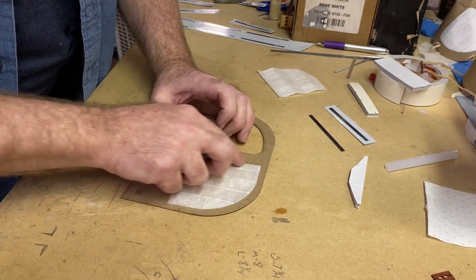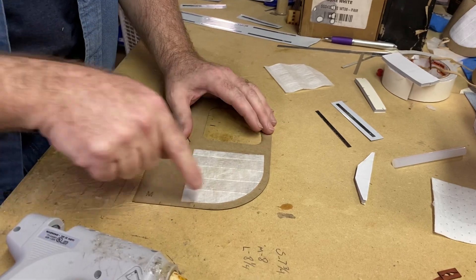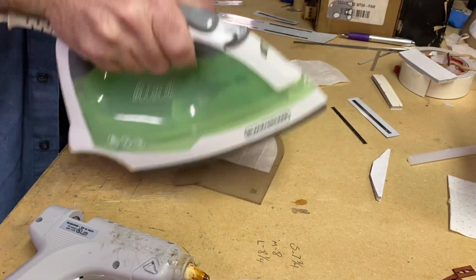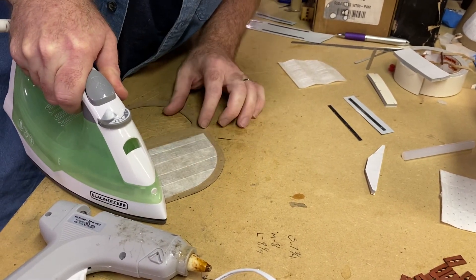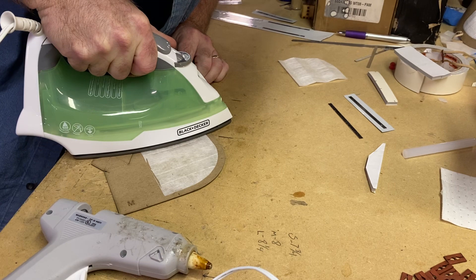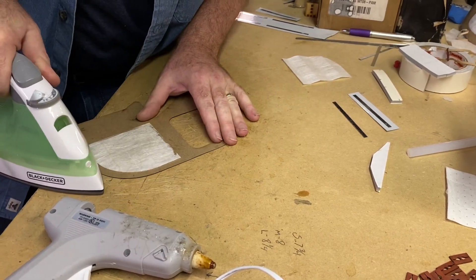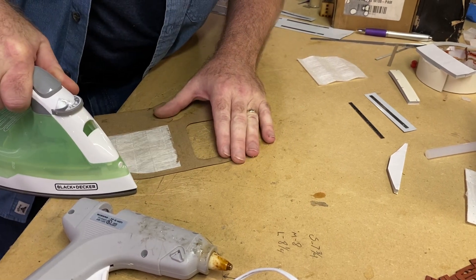Basically what I do is I just run a bead of hot glue, low temperature, around the perimeter and then I'll take an iron and iron around the edge. I try not to get in the middle itself because we don't know what heat does to the filtration ability of the material. So I'll just go around the edges here, staying out of the center, and make sure that this is bonded down very well to the cardboard.